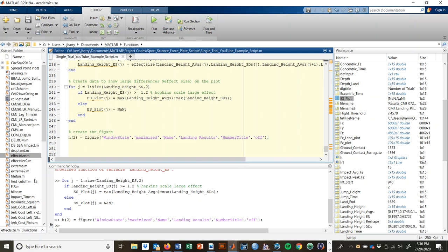Then in the second row, what do you want? Third row, if you have 3 rows. So the way I'm going to organize this is, the top row is going to be my performance variables, or my output variables. The next row is going to be my strategy variables, temporal strategy variables, so phase, time, those kinds of things. And then the next row, or rows, depending on what I've got, are going to be my force strategy variables, or what some call driver variables.